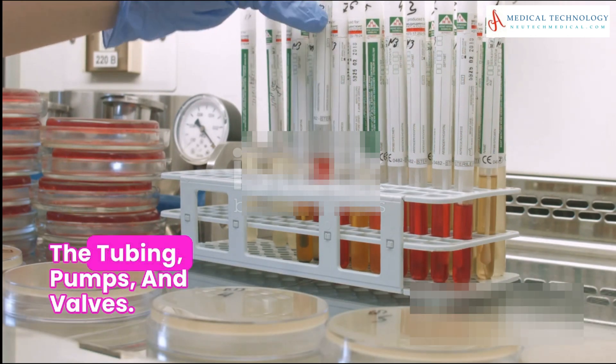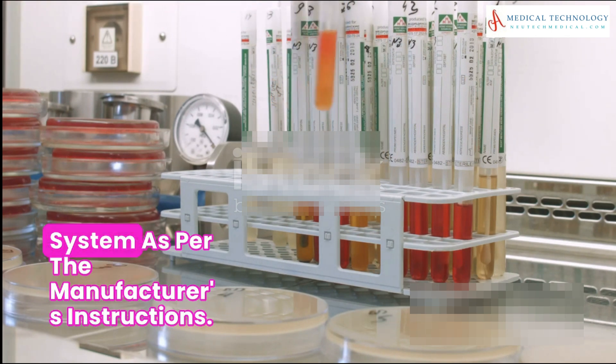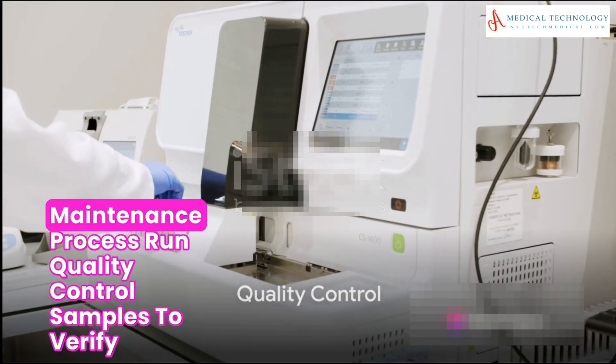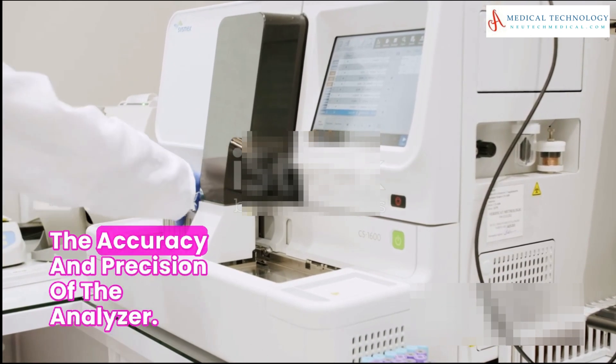The fluidic system is another area to check. Look for blockages or leaks in the tubing, pumps, and valves, and don't forget to prime the fluidic system as per the manufacturer's instructions.